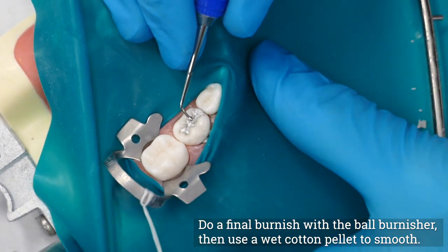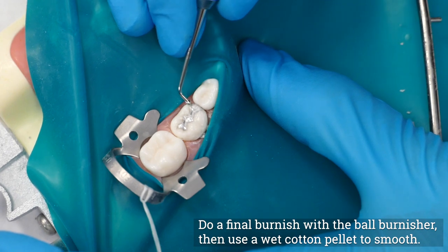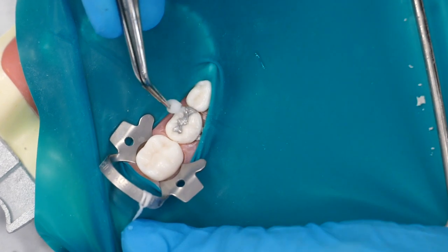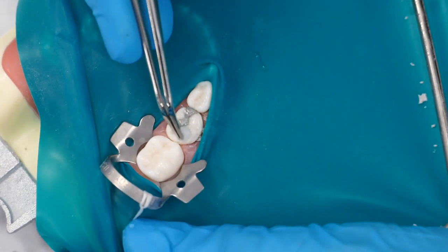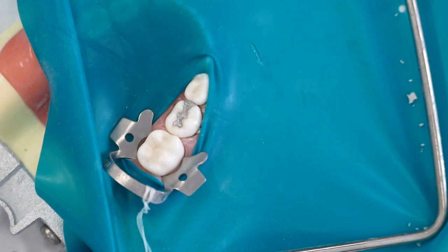Do a final burnish of the restoration with a ball burnisher, and use a wet cotton pellet held with cotton pliers for a final smoothing if necessary. Remove the rubber dam and check the occlusion for irregularities with articulating paper, and adjust as needed.